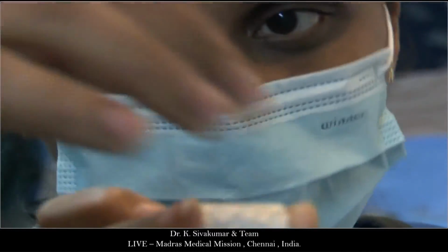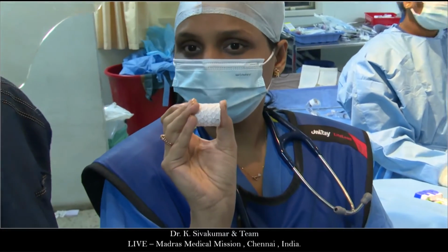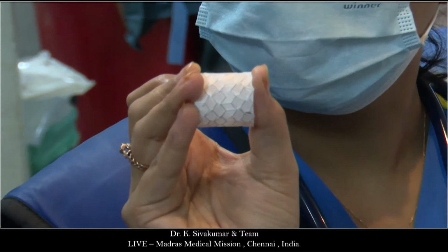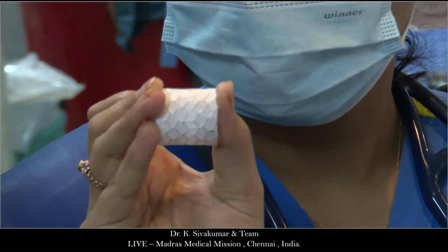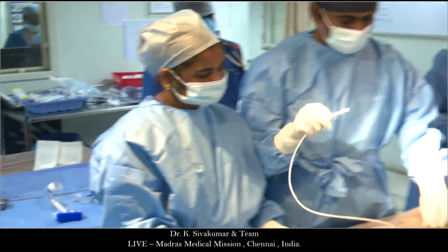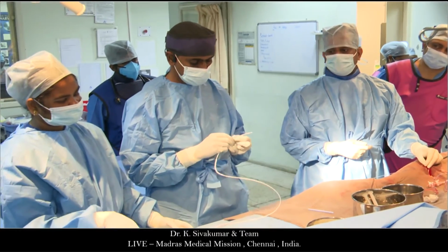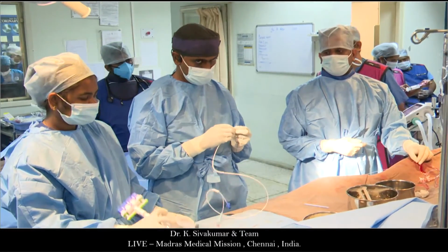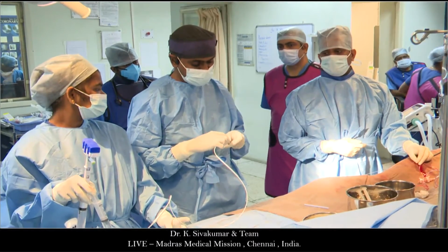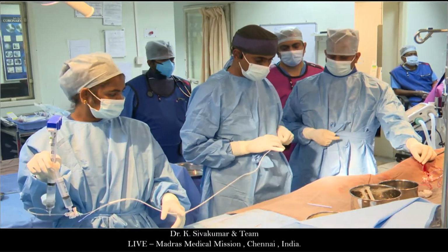The method of making the stent is called sintering. Basically, they heat the stent to just below its melting point and allow the PTFE to fuse over the metal struts, the cobalt chromium metal struts. That's why I was asking what the mechanism was, because you were trying very hard to remove the covering otherwise. No, it doesn't go away. It is quite strong.